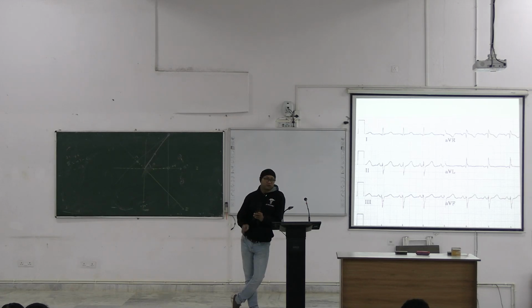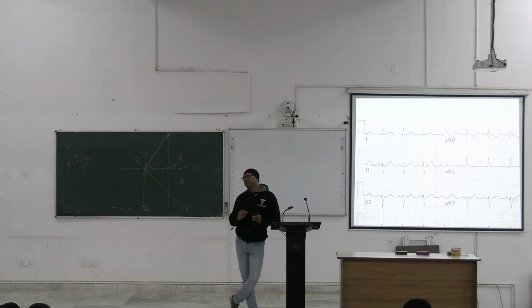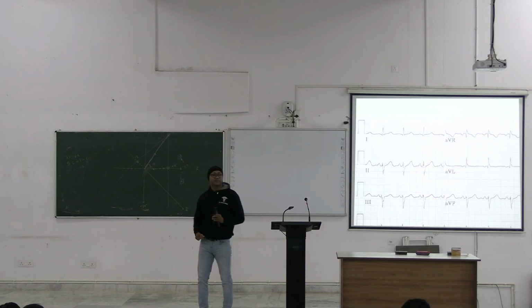It is a basic competency in the first professional MBBS curriculum. You need to be able to calculate heart rate from an ECG, and you need to be able to calculate ECG axis. But remember, this is for learning purposes.